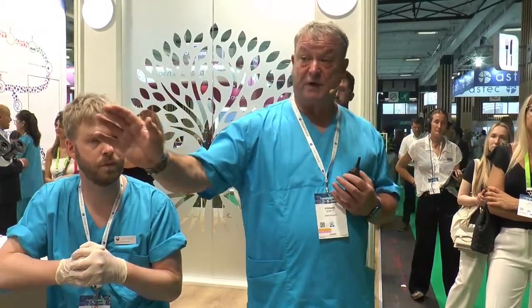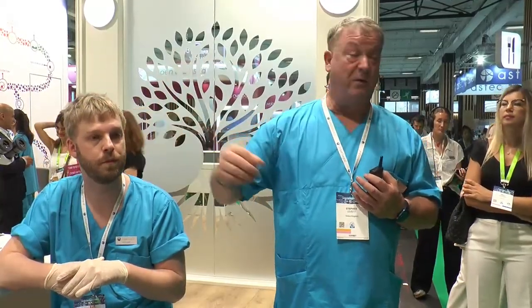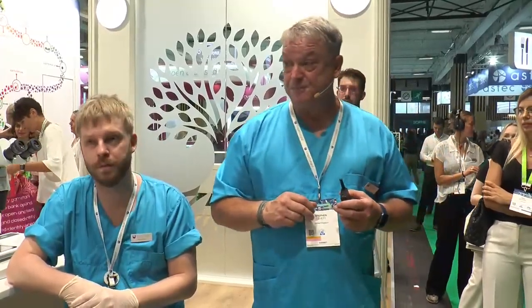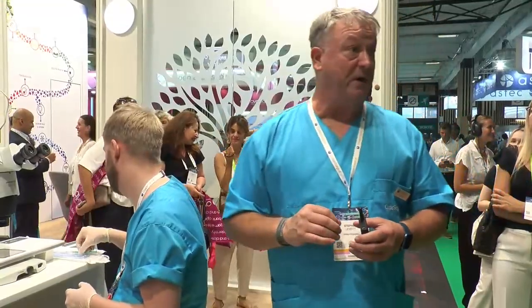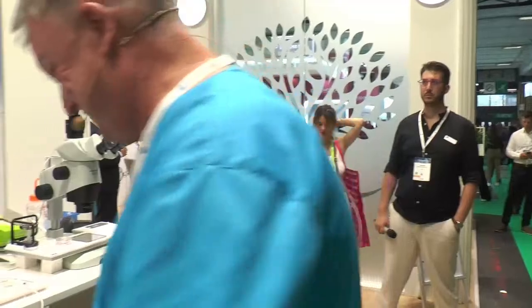So I'm just going to demonstrate one way of doing the embryo transfer on the simulator so I can show you how it works. And then after that, if anybody wants to come, have a try, talk about different loading techniques, then please come forward and we'll happily demonstrate it to you. So once Anton is finished loading, he would come through to the operating room, hand me the catheter, and I'll do the embryo transfer. And I'm hoping it goes smoothly. Fingers crossed.